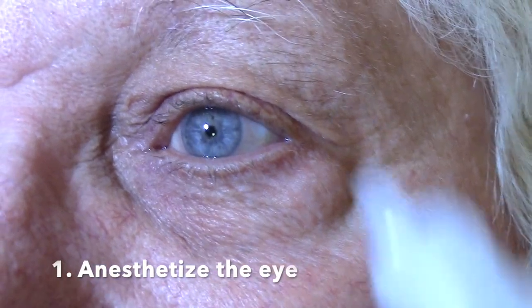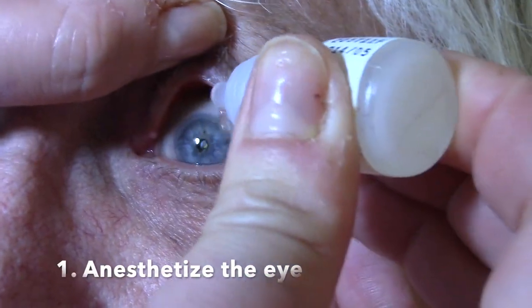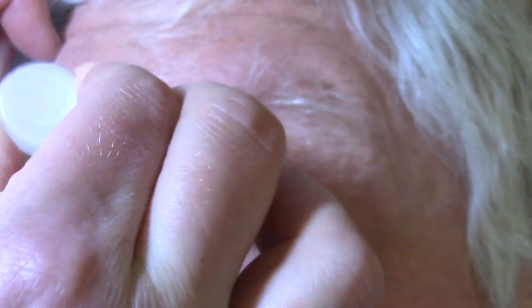The first thing we're going to do is put a little numbing drop in here. Remember, these sting, so you might want to warn the patient that they sting quite a bit. You get that initial burn, then a really intense burn, and then it gets better.